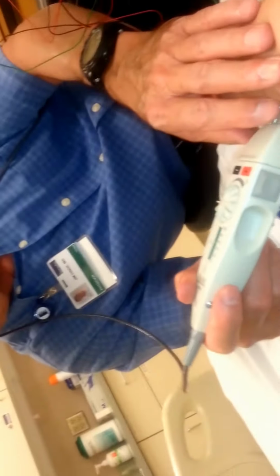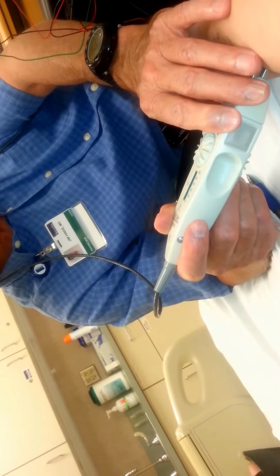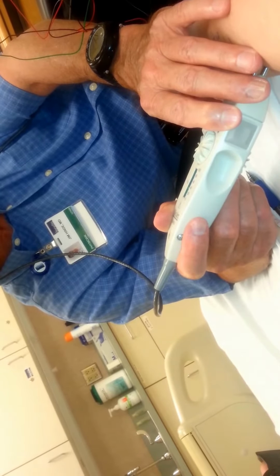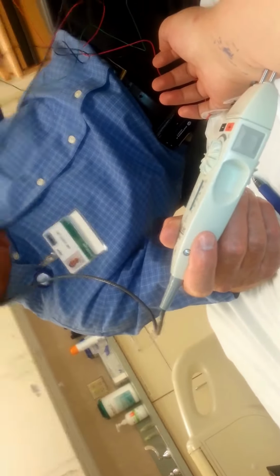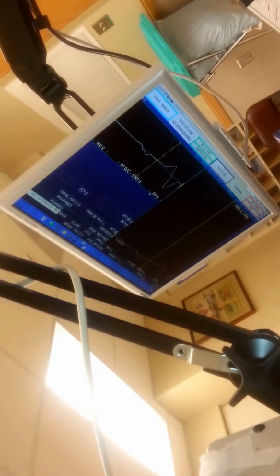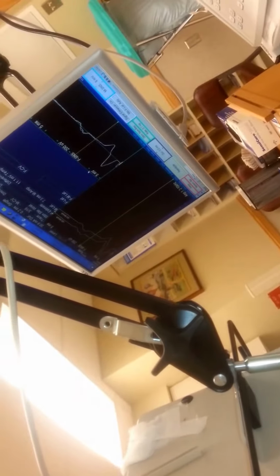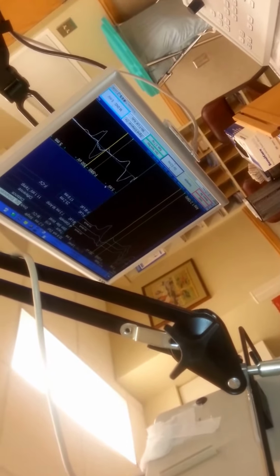Okay, so let's bring your arm down, and we'll send it up to the neck and follow it on back down. So I'll back down and shock. Good. So the first wave on the line is going across the wrist. That's this one. And this wave is the F wave, returning from the neck. So we can look at how fast it takes to travel up your arm to your spinal cord and then back down.